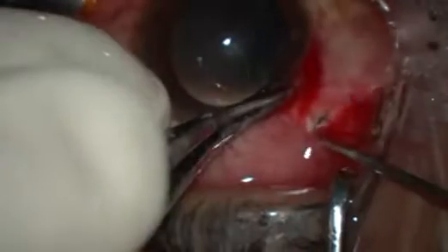After placement of ports and initial core vitrectomy, induction of posterior vitreous detachment was done. This led to nasal retinal break formation owing to abnormally thick vitreoretinal adhesions. After complete vitrectomy and membrane removal, the cyst was brought into the vitreous cavity through the nasal retinal break with the soft tip cannula to avoid damage to the globe.